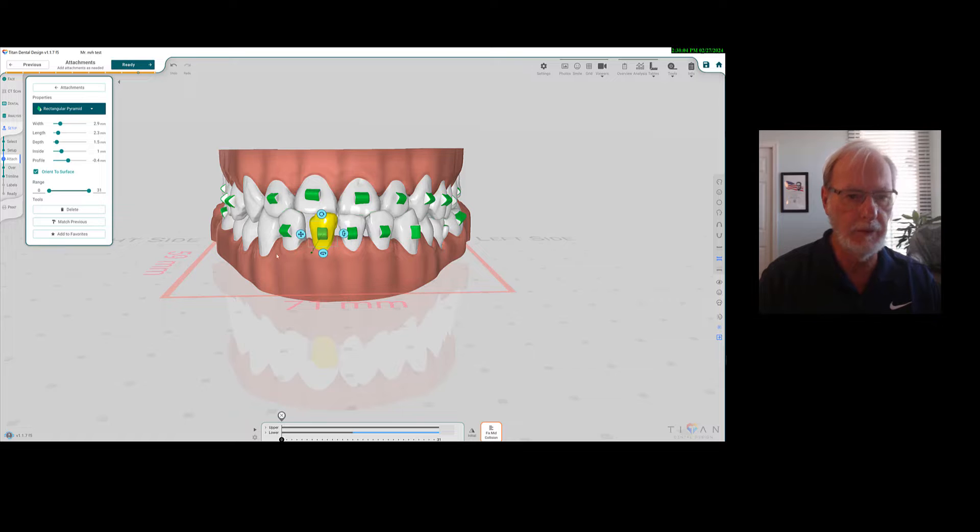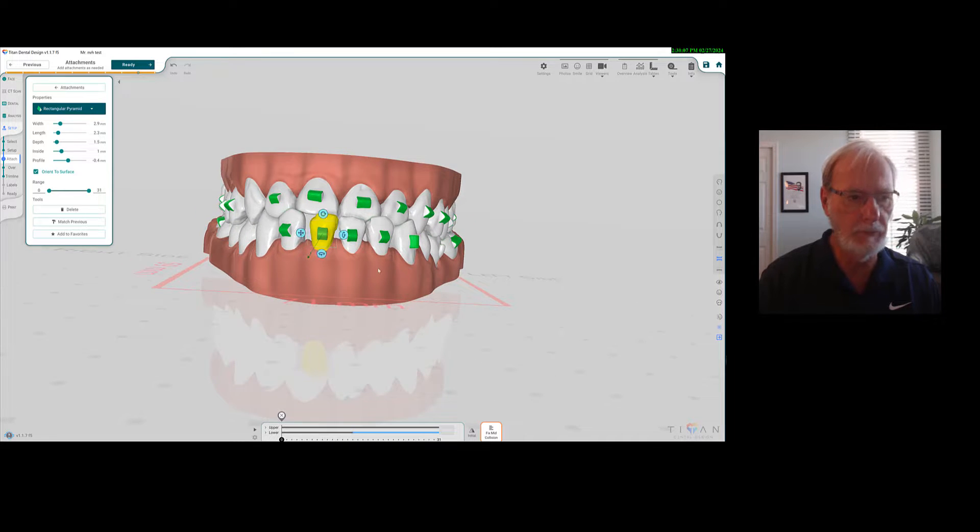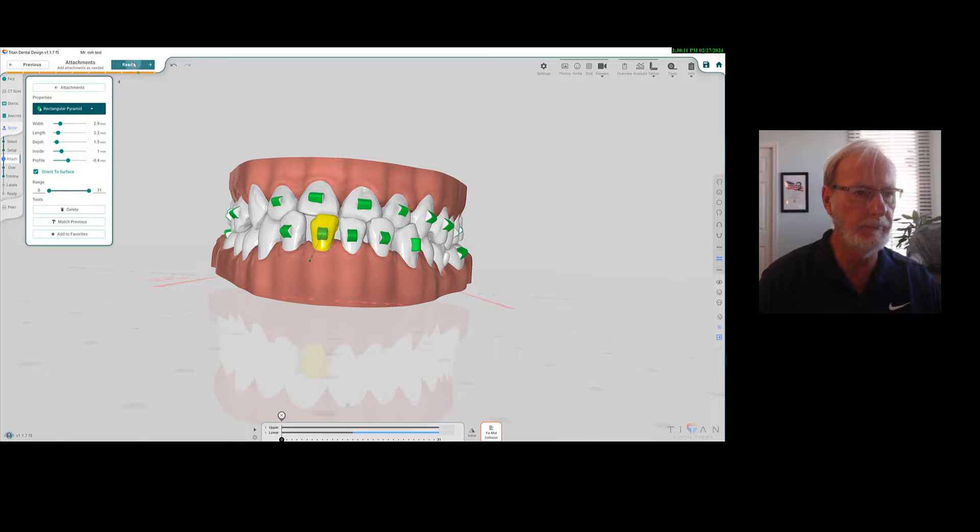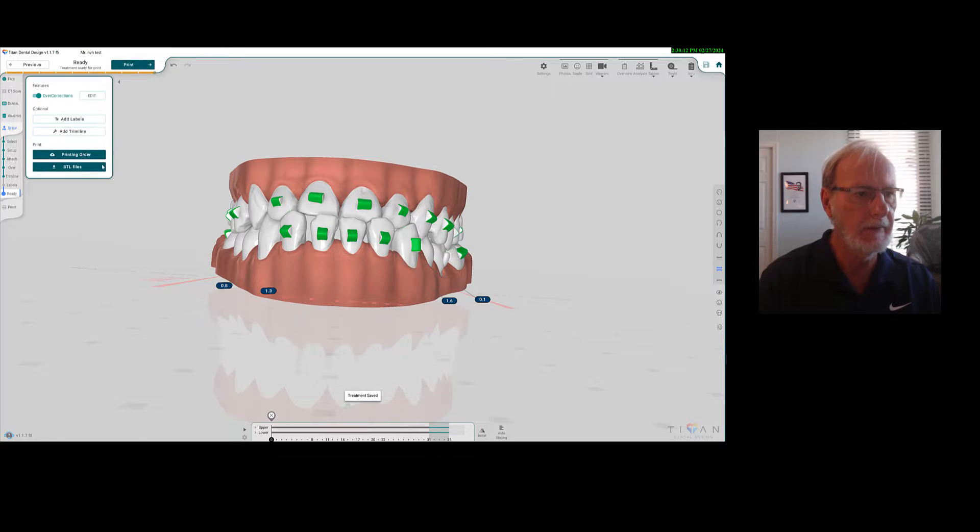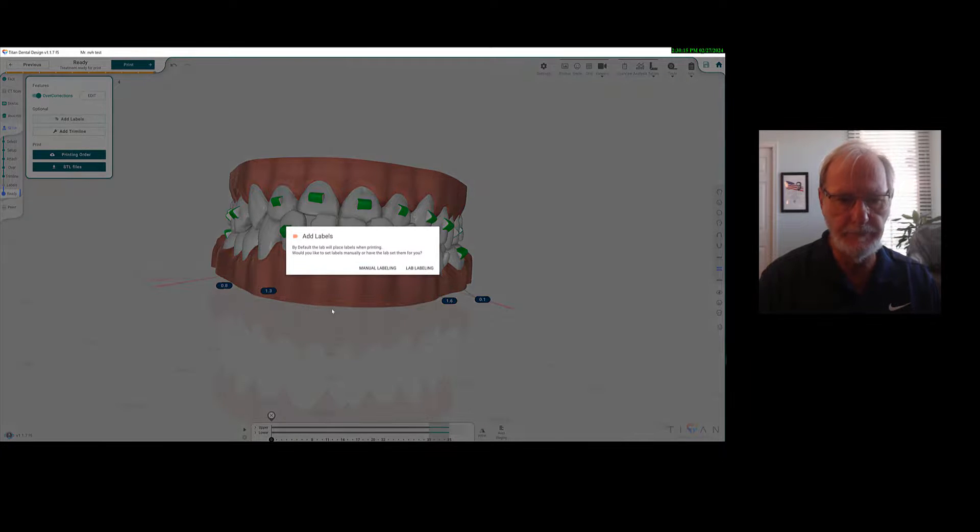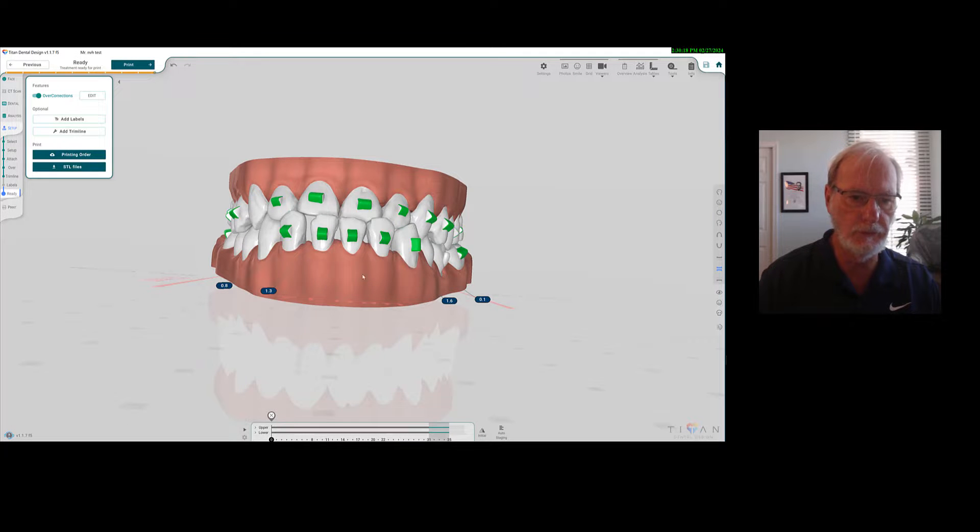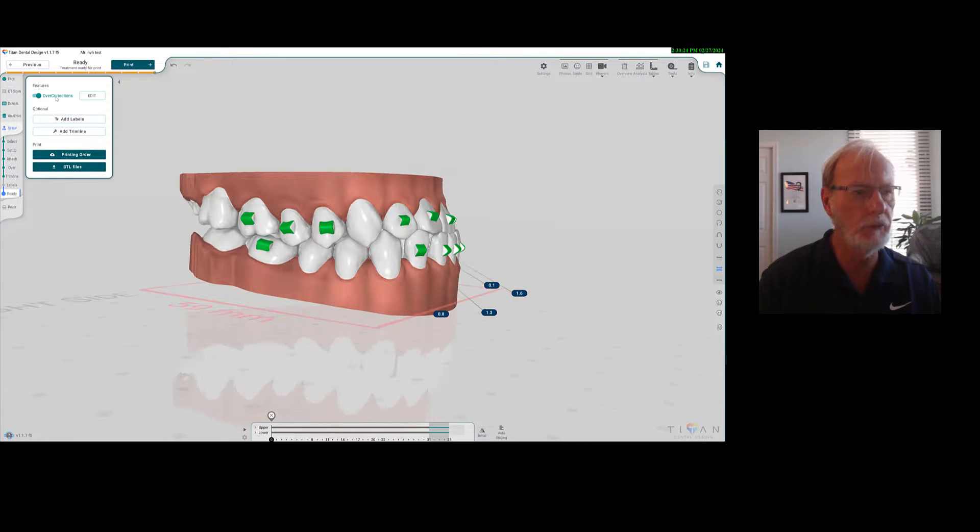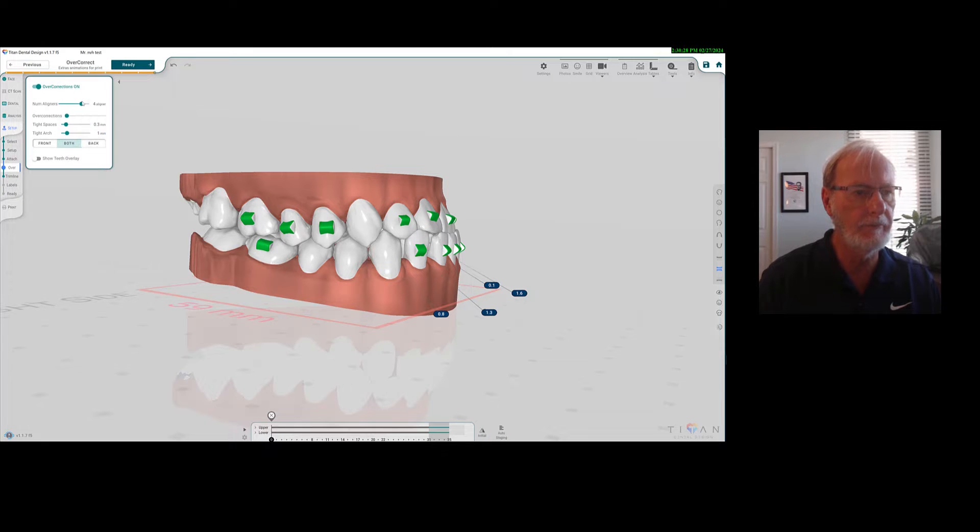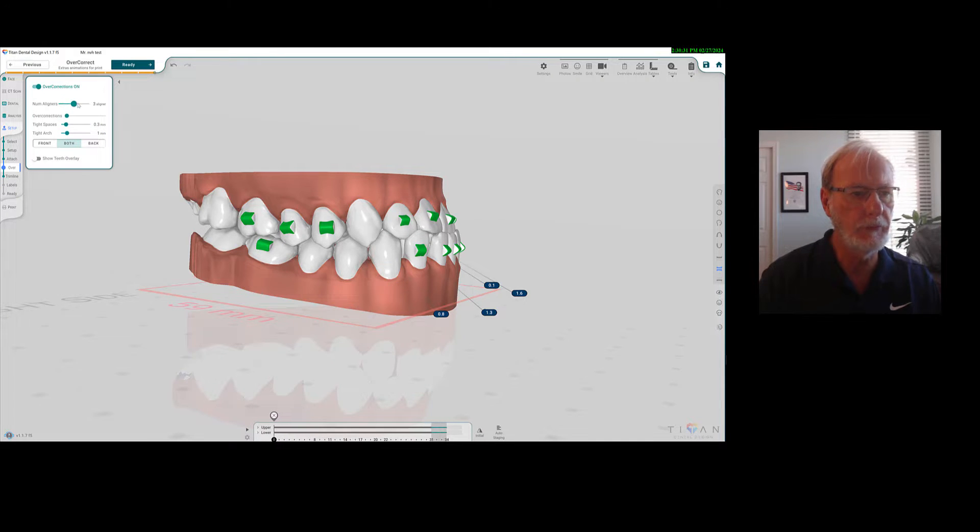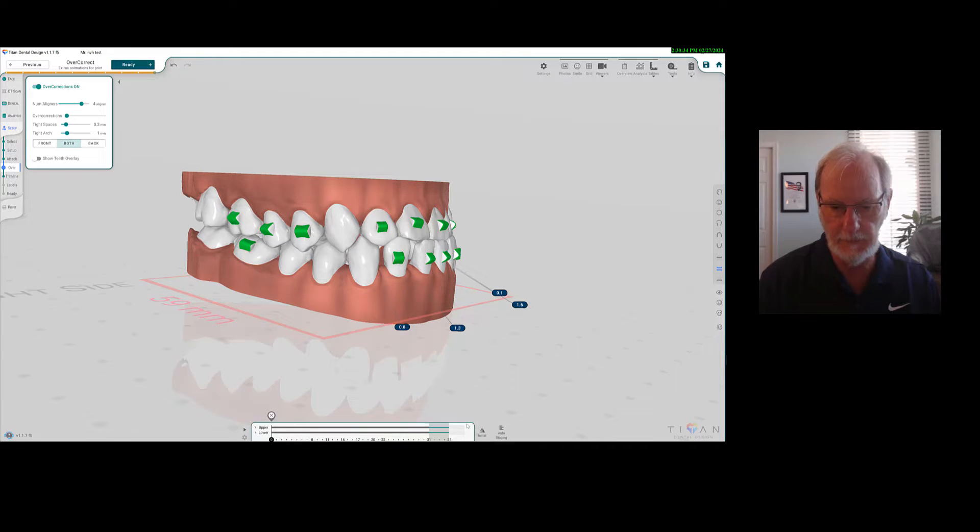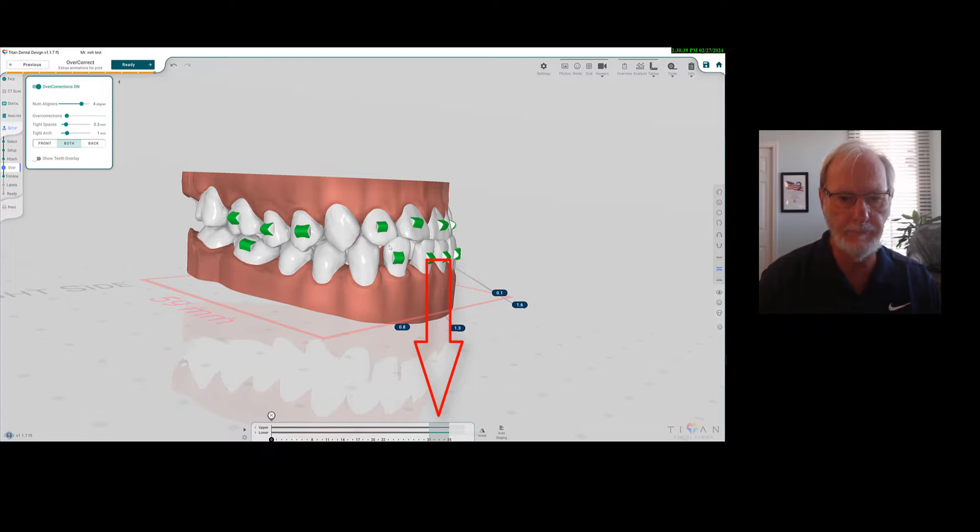Then you have done the attachments. I think the labels will come after. I'm pushing, and you can add labels, as I just said. You can do lab labeling if you want to, so your lab will do it for you. You can also do overcorrections right here. Can you see it? You can decide on one, two, three, four, five, whatever you want, and you will see that they are coming right here. That's kind of nice. I like that.